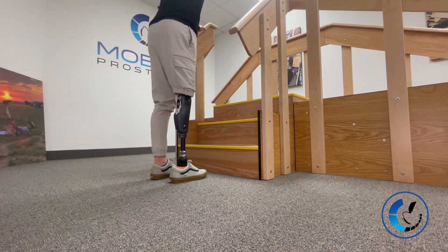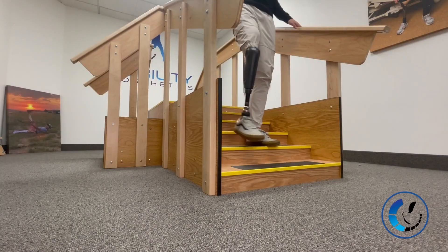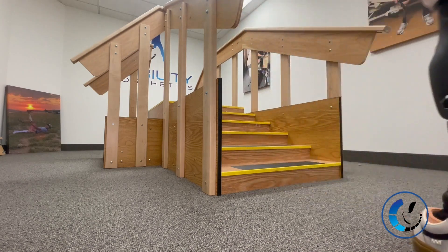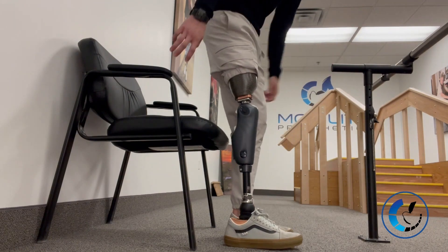Stair descent is your standard controlled descent — nothing groundbreaking but still controlled and comfortable. Sitting is the same — just riding that yielding down into a nice comfortable sit.